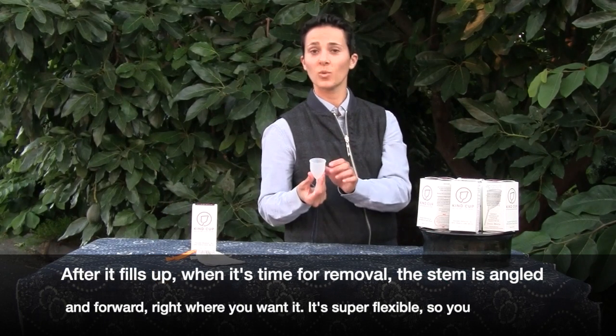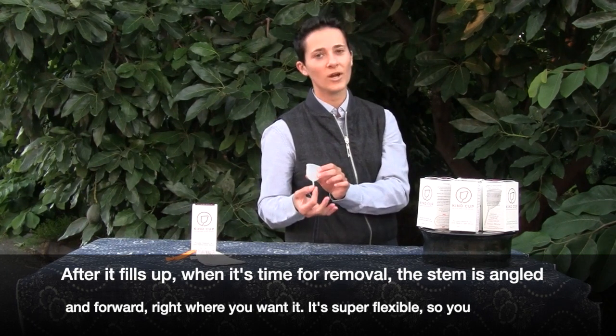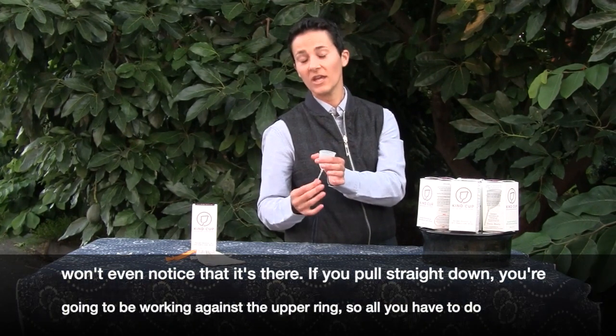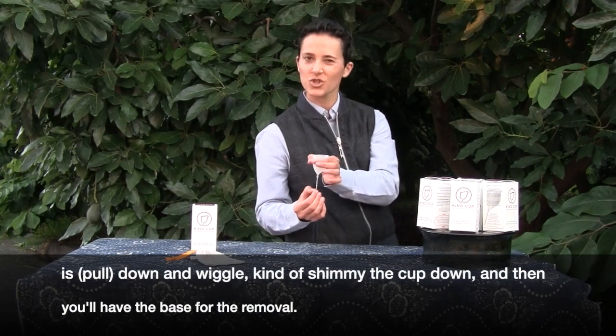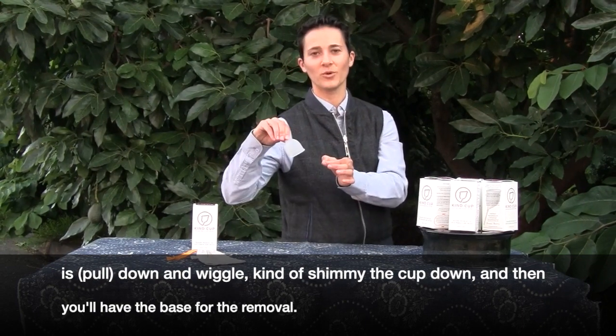After it fills up, when it's time for removal, the stem is angled and forward and right where you want it. It's super flexible, so you won't even notice that it's there. If you pull straight down, you're going to be working against the upper ring, so all you have to do is go down and wiggle, kind of shimmy the cup down, and then you'll have the base for the removal.